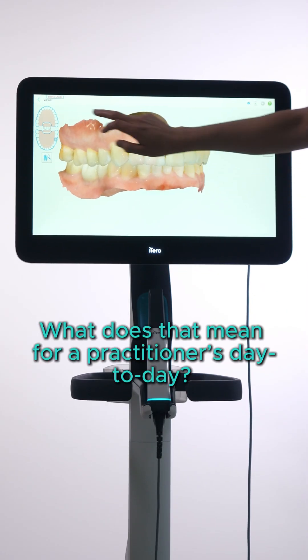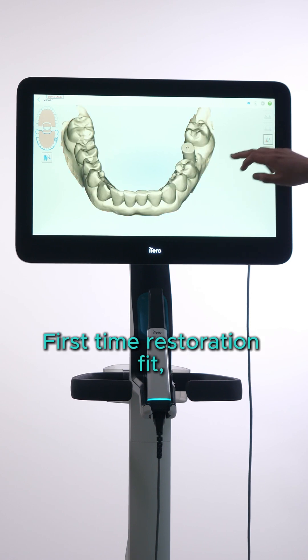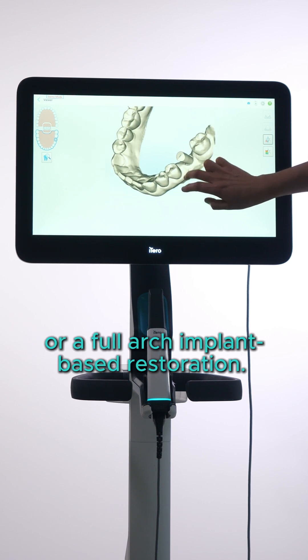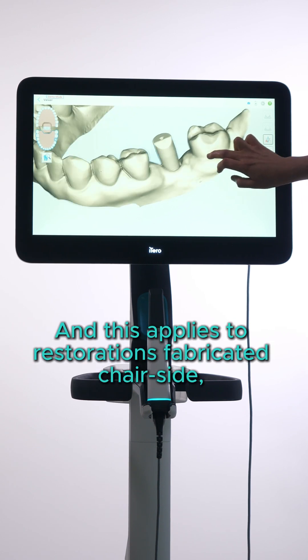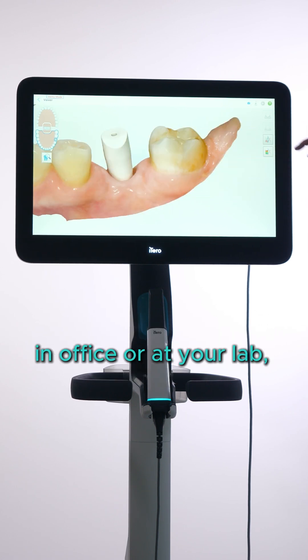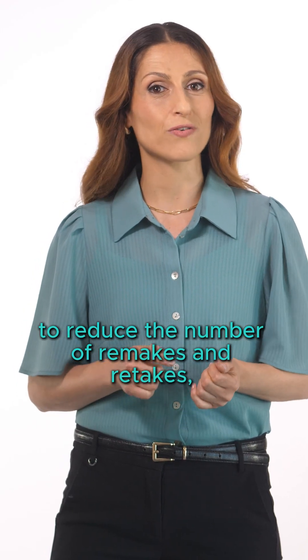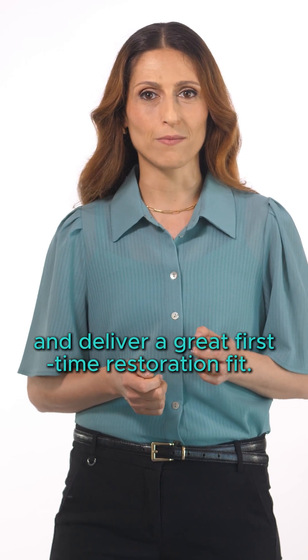What does that mean for a practitioner's day-to-day? First-time restoration fit, whether it be a single crown, a bridge, or a full arch implant-based restoration. And this applies for restorations fabricated chair-side, in-office, or at your lab, because the scanner is designed to reduce the number of remakes and retakes and deliver a great first-time restoration fit.